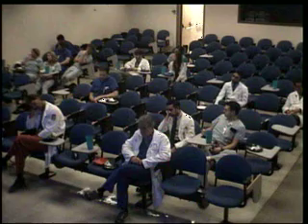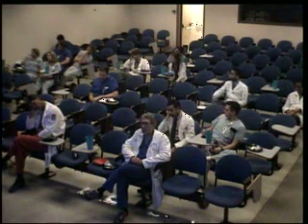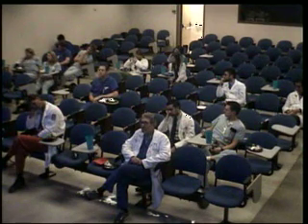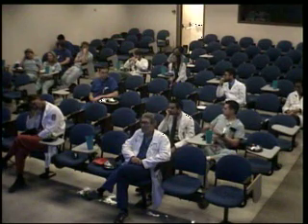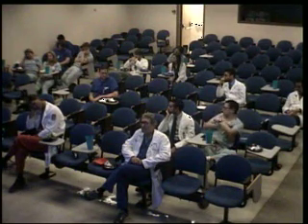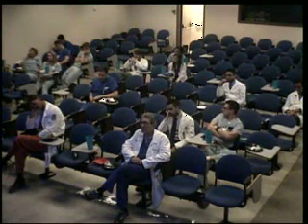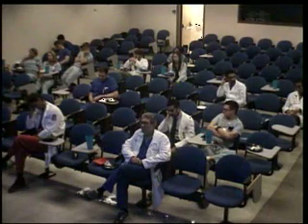And then you need to see a delay also, which tells you exactly whether that is contrast, just like a bleed that you see, it becomes bigger. So then you can target that area. So CT is definitely far higher resolution, far more specific for finding endoleaks, but if you can't, then you do MR. It tells you the sac is becoming bigger, but not why and how to treat it. Thank you.